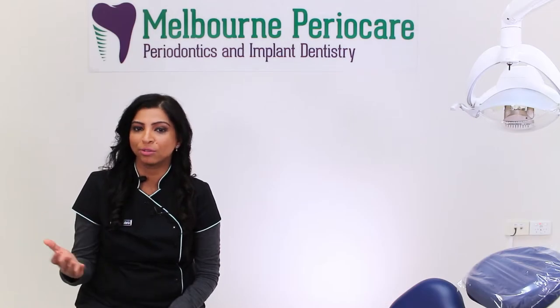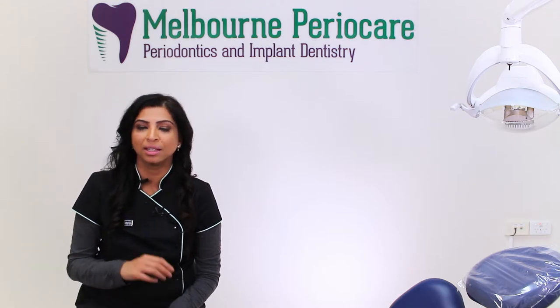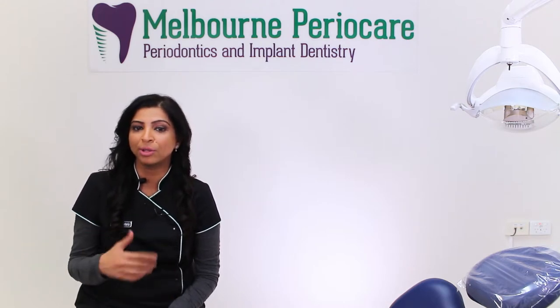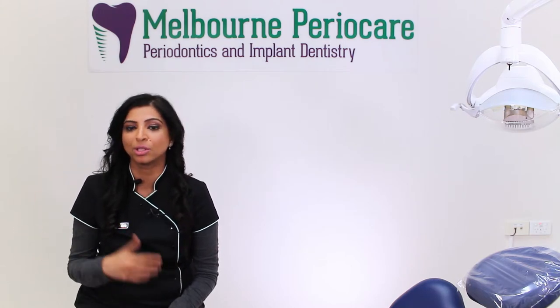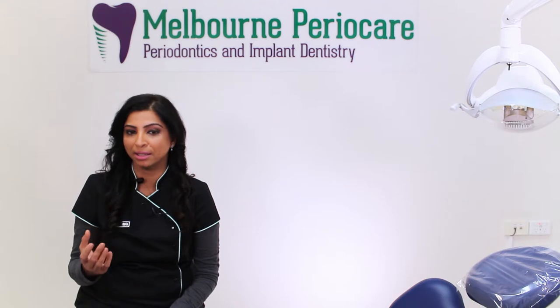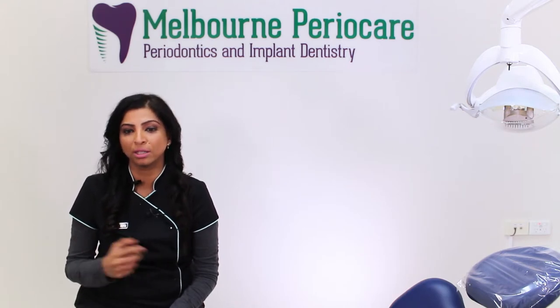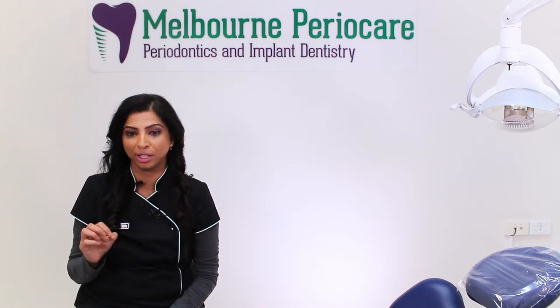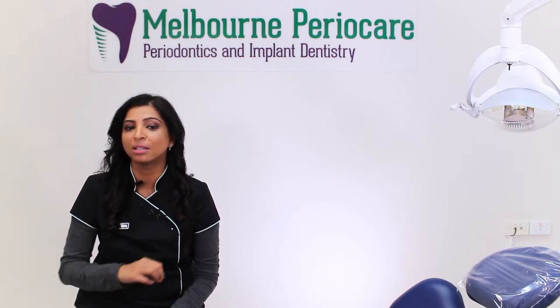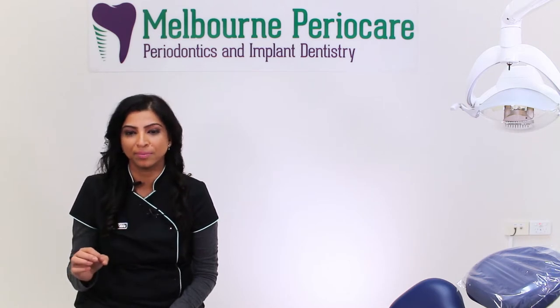So with the advent of cone beam CT, things have changed. We now have a three-dimensional analysis and diagnosis of furcation involvement, which is possible. The main advantage of cone beam CT as compared to the traditional CT scan is its high accuracy, high resolution, and low cost. In 2010, Walter and co-workers reported that CBCT, in an intrasurgical evaluation of maxillary molar furcation involvement, was found to be in substantial agreement.